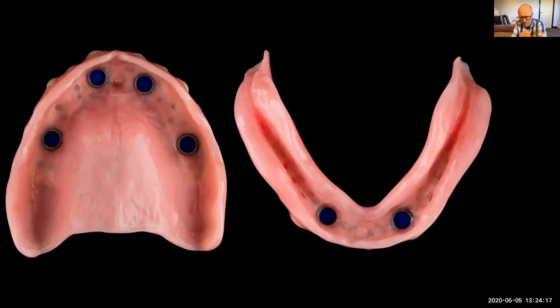So you can see Lynn's dentures here. I've taken out the lab insert, the black insert, and I've just put the blues in here. So that's what I like to use, just blues, the lightest grip possible. And then we can increase that further on down the line in a few years' time if need be. So here's Lynn, finished and job done. And totally changed her life completely.